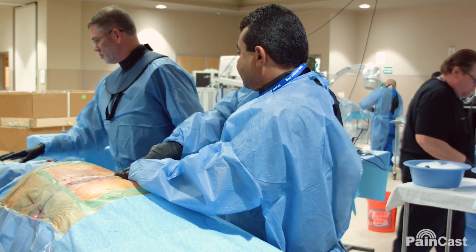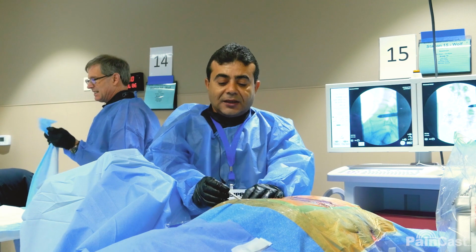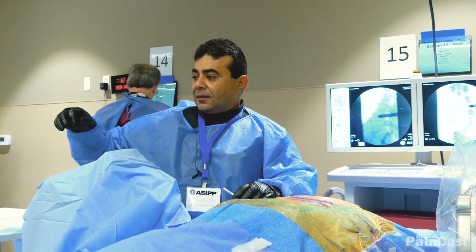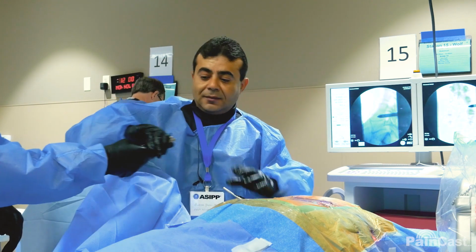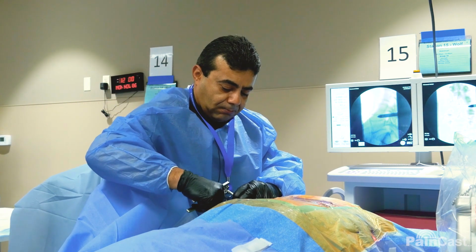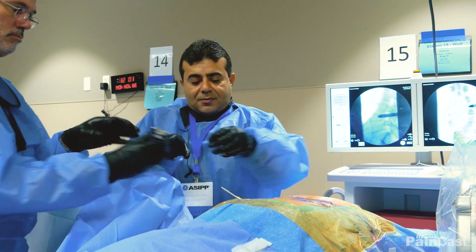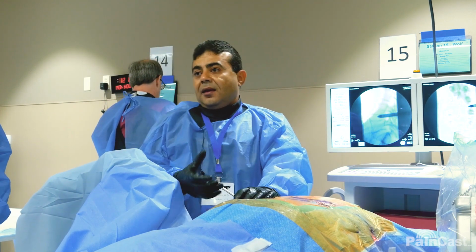So sometimes the dilator gets impacted in there, and so you don't want to hold it with any equipment.